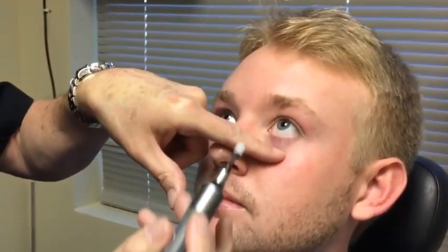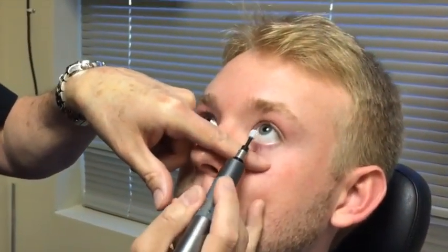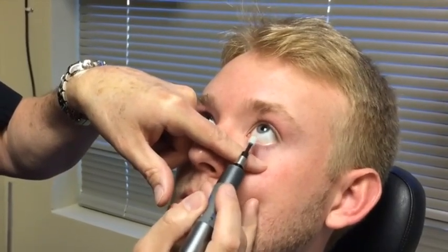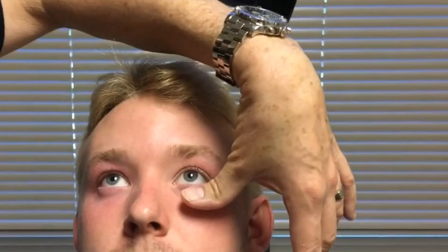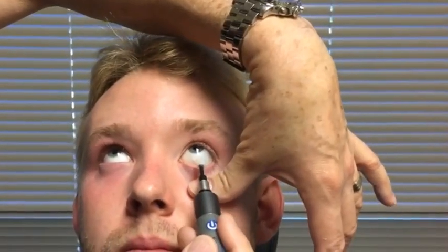Now the trick to doing the lower eyelid, you're not going to reach right straight across if we're going to treat that lower lid, because if I do that, the nose always puts the finger up in your way and you can't get the lid and do a nice treatment because of the nose. So you'll need to do this C technique, make your arm a C, reach way around, use the side of your thumb to pull down. And now you can get in nicely. You see that? It's just a reach around, the side of your thumb, pull down and expose the lid margin.